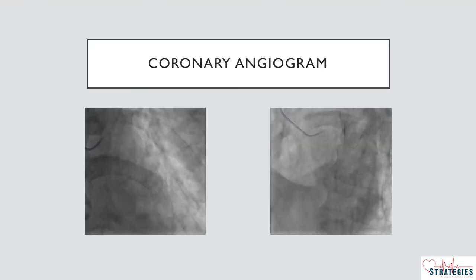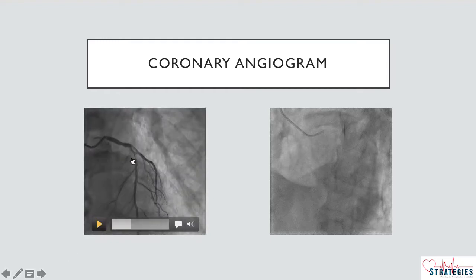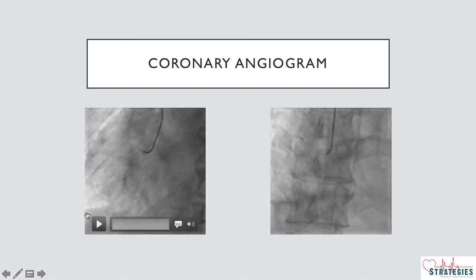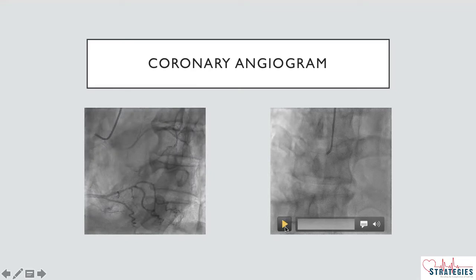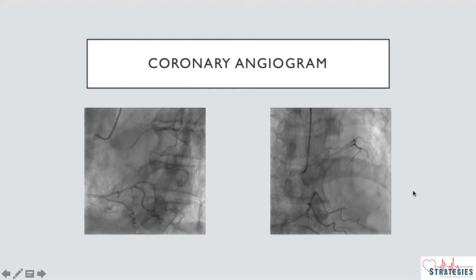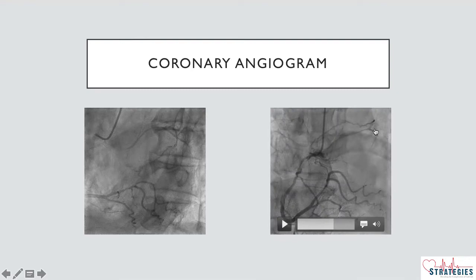This is the coronary angiogram. You can see this is the LAD, which showed a significant lesion in the proximal LAD, and there is no LCX coming here, which was actually coming from the right sinus. So proximal LAD has significant disease, and this is the RCA, which is showing significant disease ostioproximally as well as diffuse disease. And we can see LCX is coming anomalously from the right sinus and filling while injecting into the RCA.